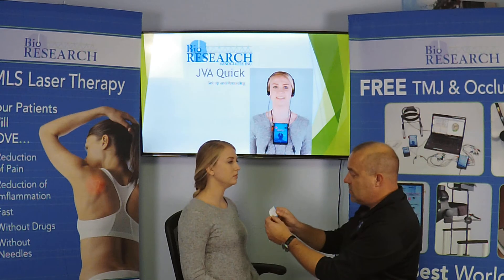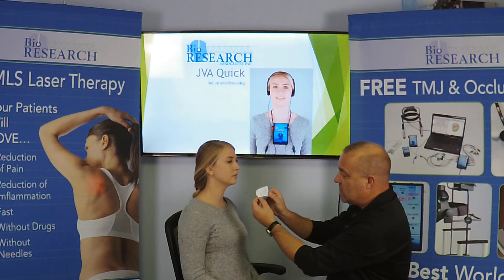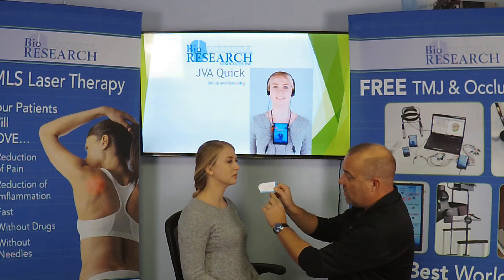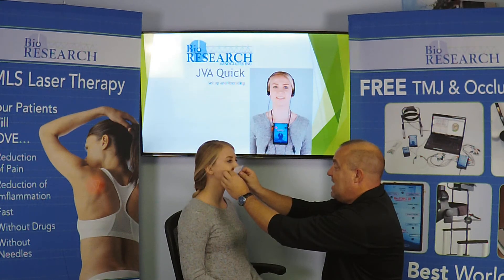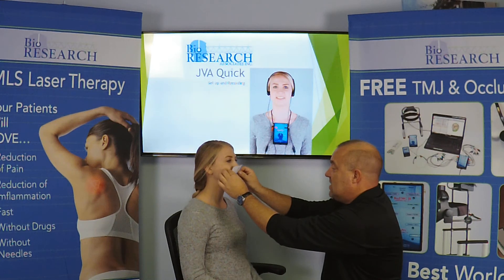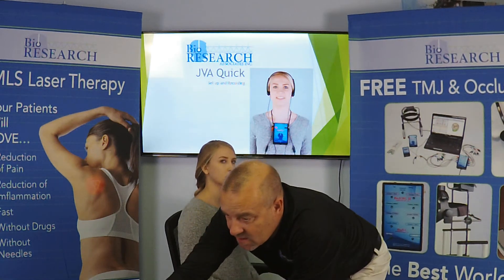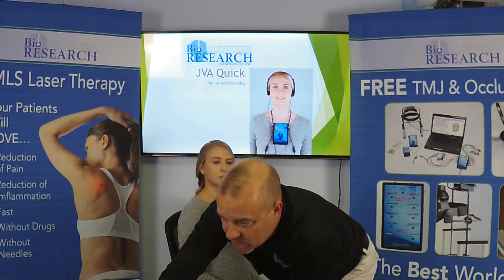For lateral excursions, take the range of motion card — there's a graduation on the bottom with an arrow. Place that arrow right on the center of the incisors, then ask the patient to slide their jaw all the way to the right: that's 11 millimeters. Back to center, then all the way to the left: that's about 12 millimeters.